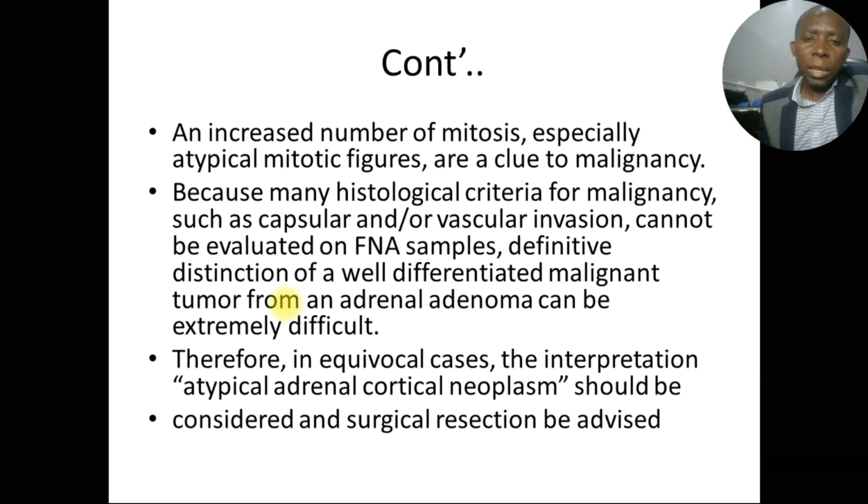What we do in this case, it is always important to take a biopsy and maybe do a cell block, and this can really help to differentiate the malignant tumor from the adrenal adenoma, because we realize that in cases of metastasis there is invasion of the nearby tissue, and this cannot actually be seen because in cytology we are looking specifically at cells, so we may not be able to demonstrate how far it has spread through different margins.